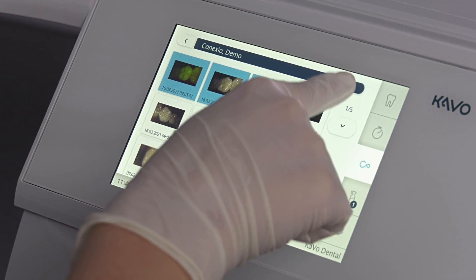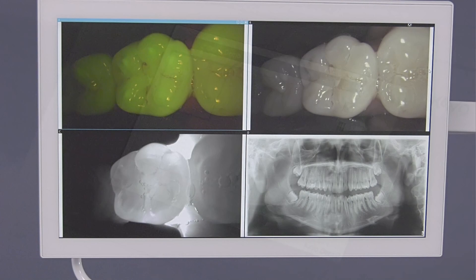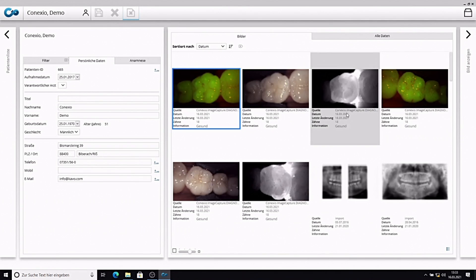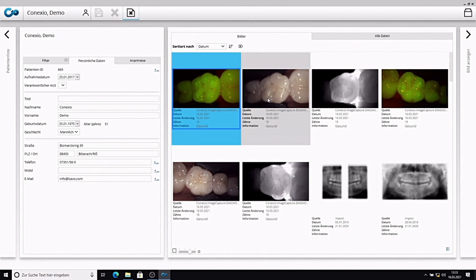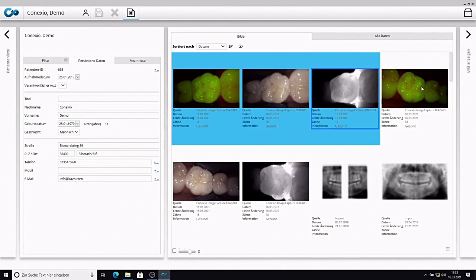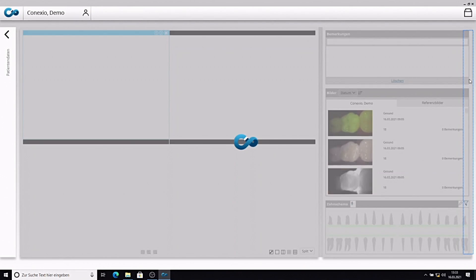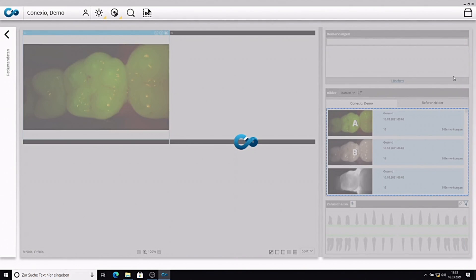The images saved during the treatment can be viewed within the software or on the treatment unit's screen. To start the image display in the software, select the desired images in the patient's file and click on display images in the menu bar.